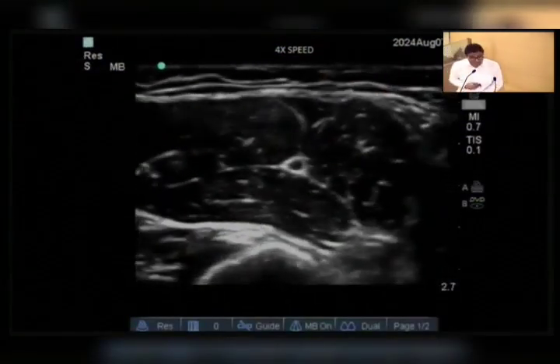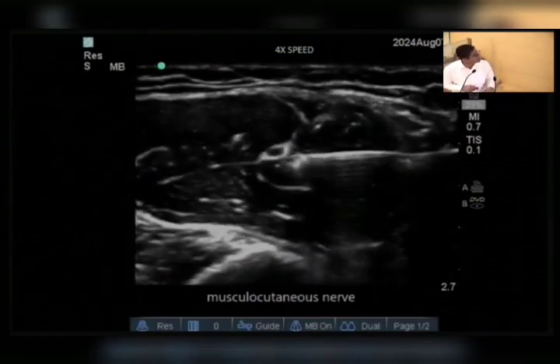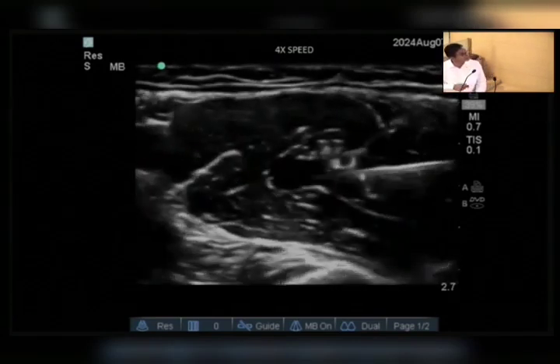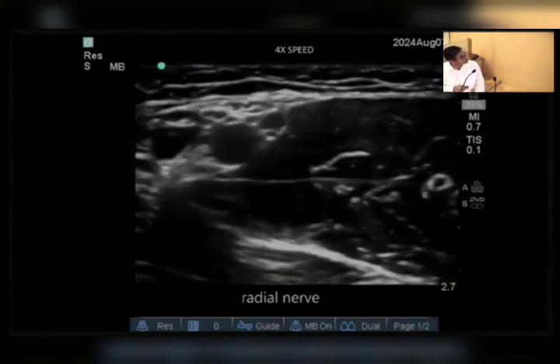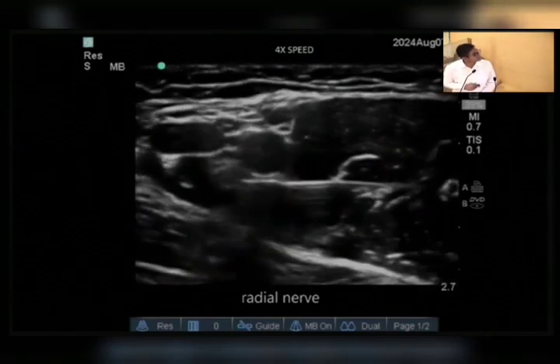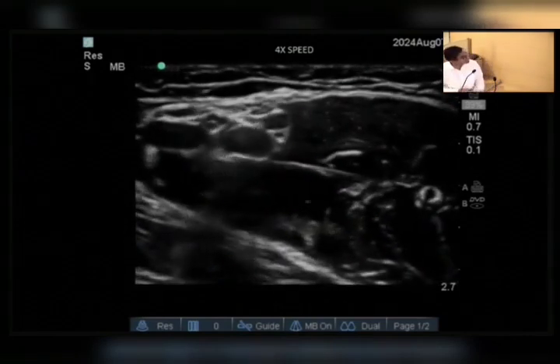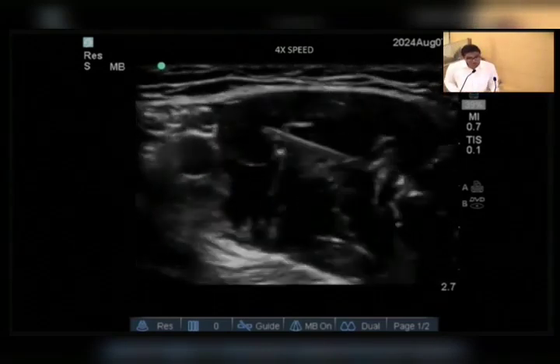See, this is the conjoint tendon, which is a very important landmark, because our drug should be deposited just superficial to the conjoint tendon. Okay. So this is 4x speed actually. See, I am directing the needle from cephalad to caudal targeting the musculocutaneous nerve, and I will inject 5 to 7 ml of local anesthetic to block it, and then I will go posterior to the artery to block the radial nerve. After that I will go medially, and somewhere here you will find the ulnar nerve. So 5 to 7 ml for each nerve. So total volume is 20 or 25.